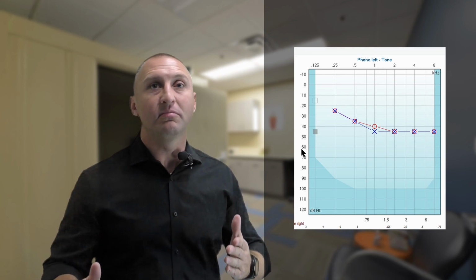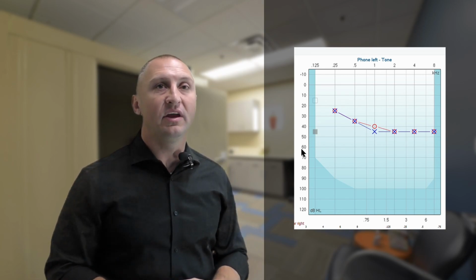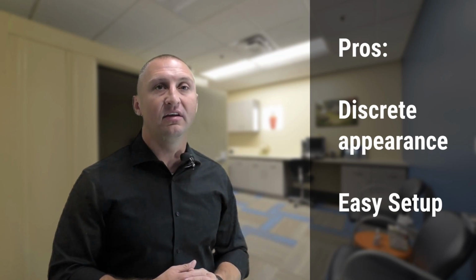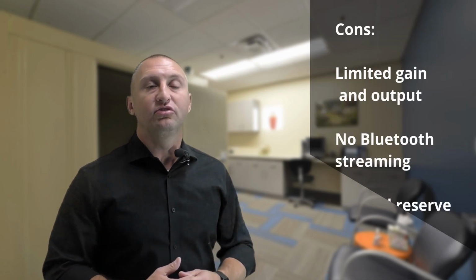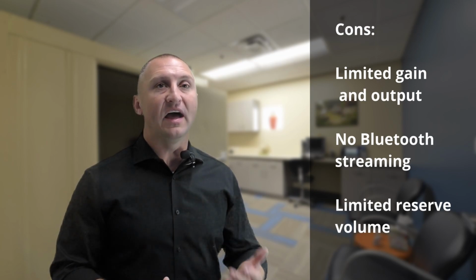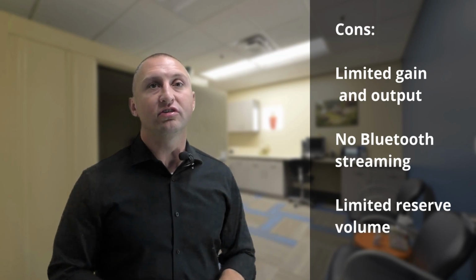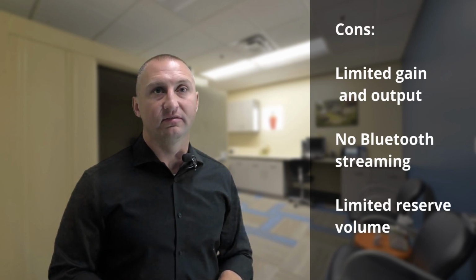Now, in full transparency, this patient's hearing is a mild to moderate hearing loss. That really is the upper fitting range for this particular device. In my opinion, it's a good product. It's packaged really well. This is a great partnership between Sony and Signia's parent company. However, I don't think you're going to see a lot of long-term gain from this product. I think patients who start with this, if they stick with hearing aids, are going to be in prescriptive hearing aids within a year. Between the feel, the need for use of batteries, the lack of Bluetooth, and of course, that reduction in mid and high frequency gain, the long-term benefits, I don't know if they justify the cost.